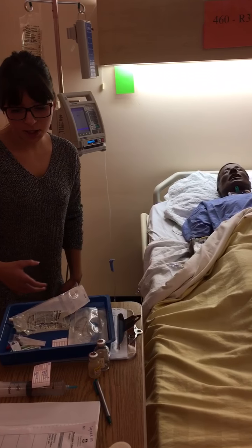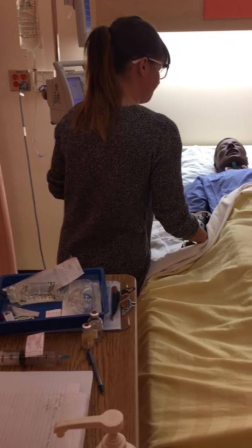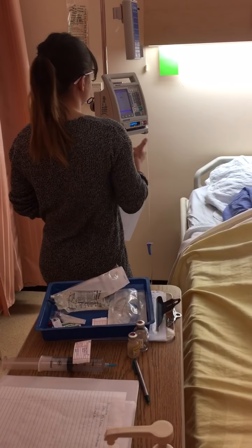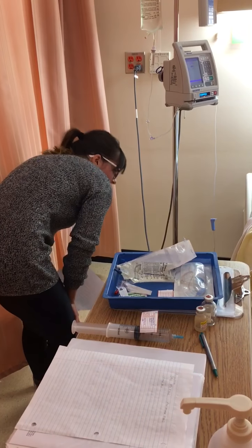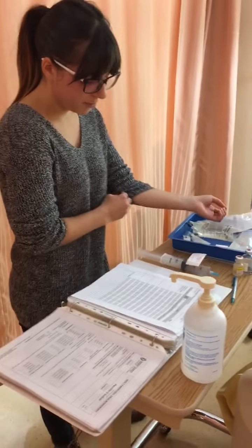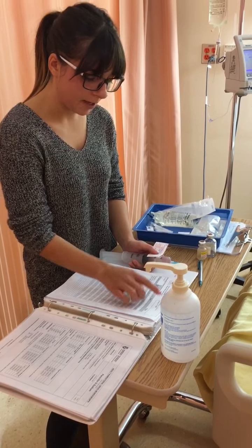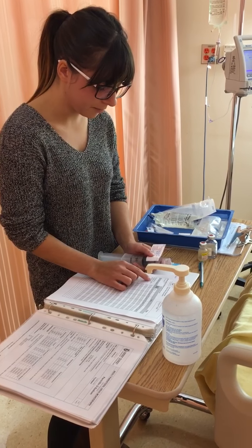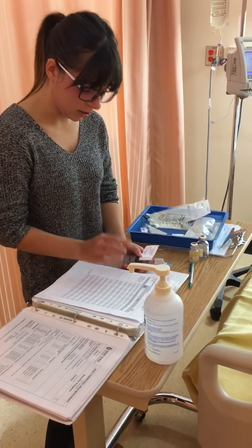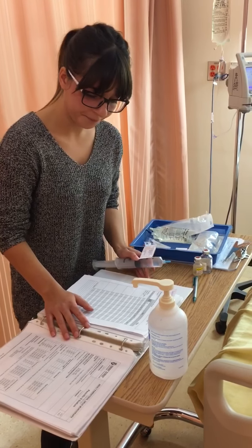Okay, so we're going to do our safety checks, making sure it's the right patient. Pablo Pitts, can you tell me your name and your birthday? Okay. Making sure that the call bell is within reach, that the brakes are on, which they are, and there's nothing around in the room here. Okay, so I'm going to do my third med check. Right drug, penicillin, right patient, Pablo Pitts, right route, IV, right dose is the 40 milliliters after the reconstitution and dilution, and right time is 11:30.